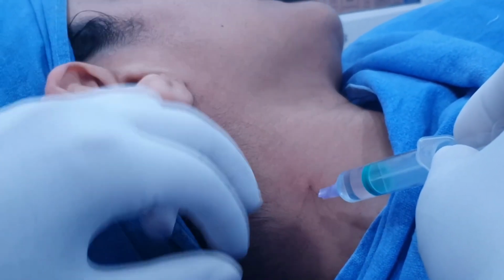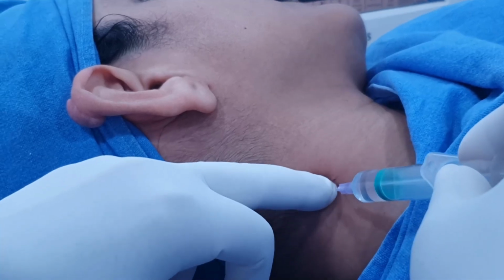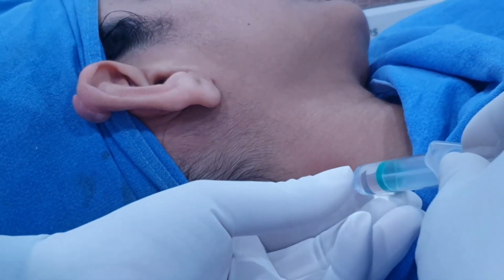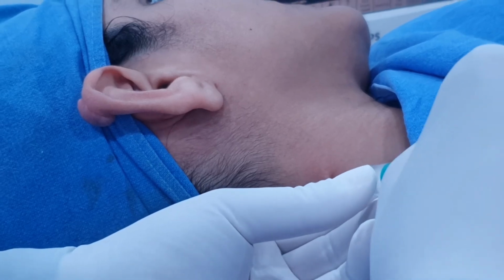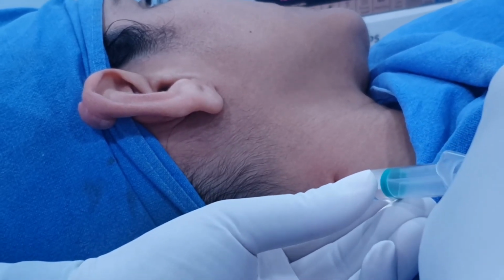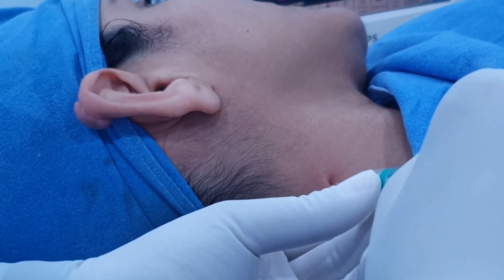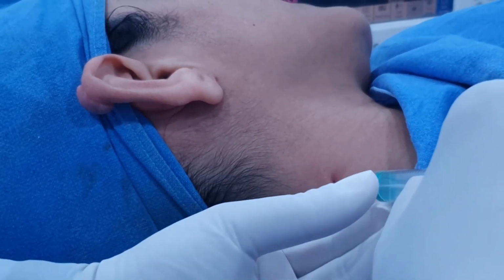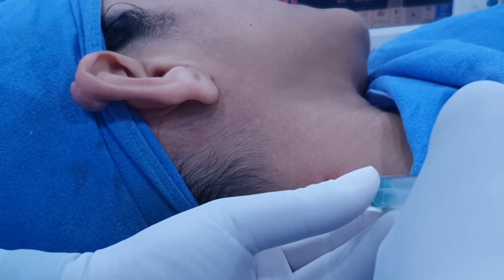Going perpendicularly, just pinch this and then insert the needle here. Always aspirate before injection. So I have taken only 1% lidocaine here.